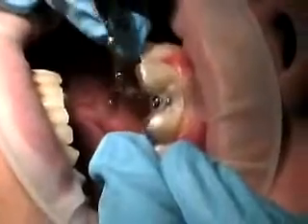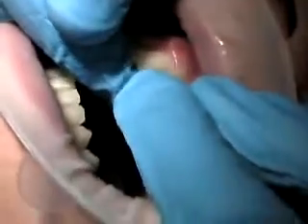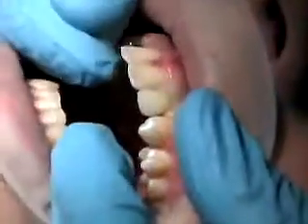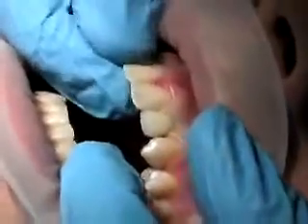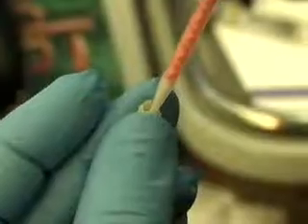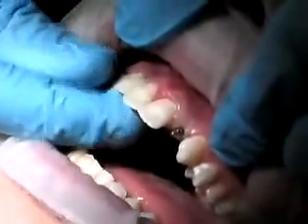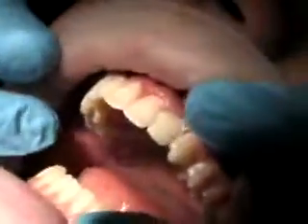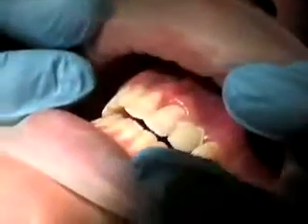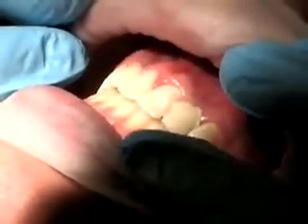The winged wrench gives you the leverage you need to screw the implant in until it's flush with the stent. When you reach this depth, you'll know that your implant is in the same position as when the porcelain crown was fabricated in the lab. Try your crown on the implant to make sure you've got a good fit. In this case, we're doing two implants with two crowns and they both look great. Cement the crowns with resin cement, the same that you would use on any crown. Then check the bite — everything looks great, so cure the resin, clean up, and send him home.